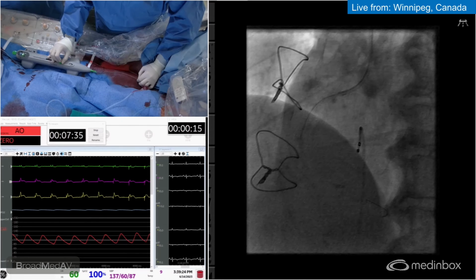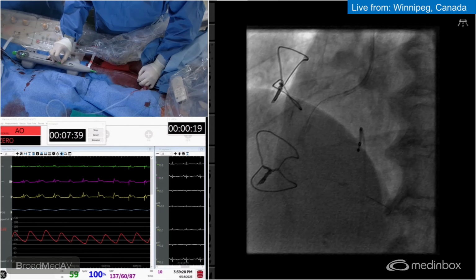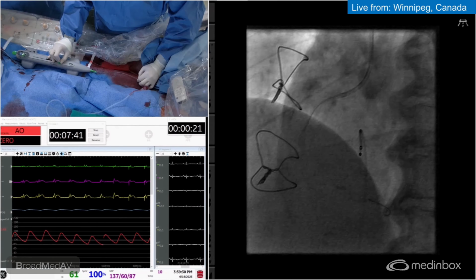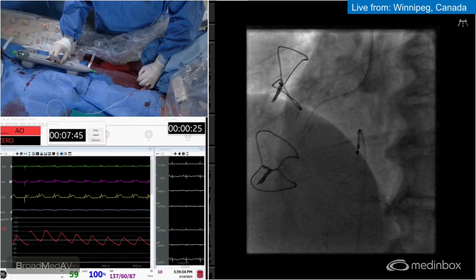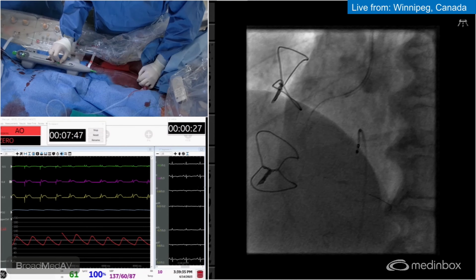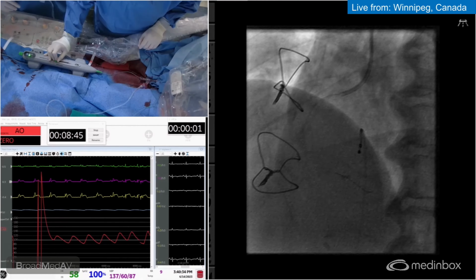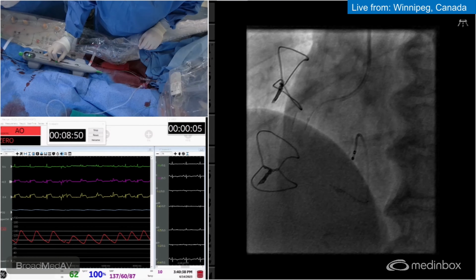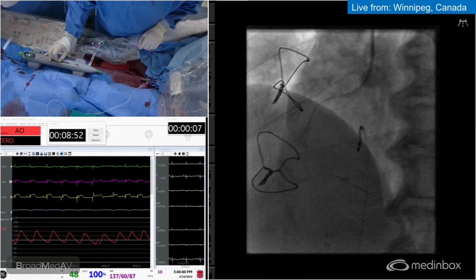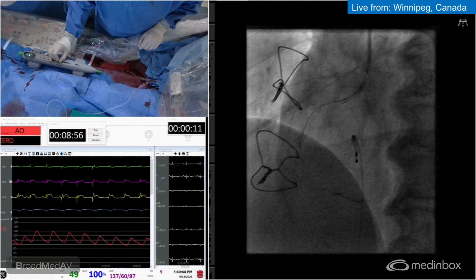I'm going to start coming back. And then we'll do more ablation on the way out. Yeah, I think you're almost out of it. That's good. Let me jump forward a little bit there. That's advancing smoothly now.